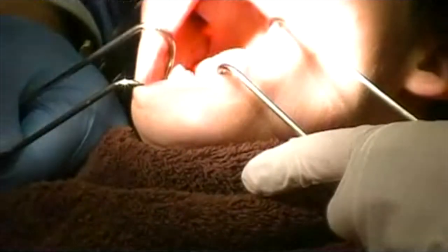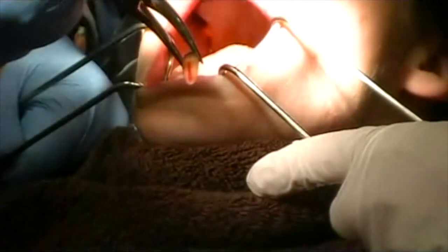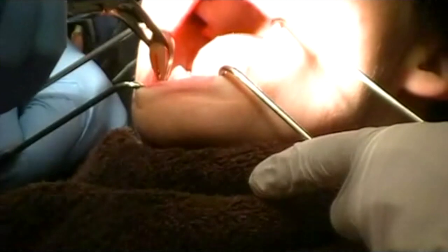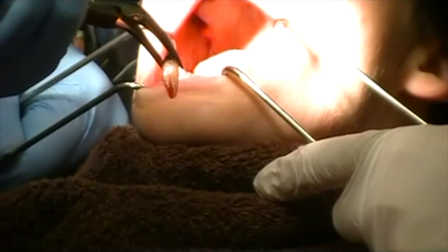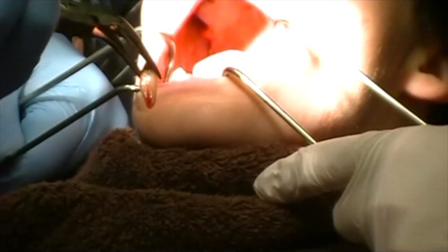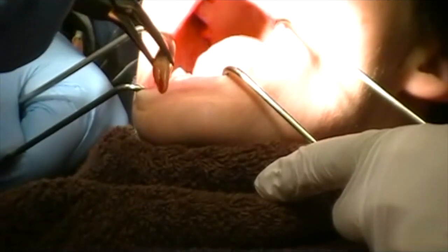Wow, look at that. Atraumatic extraction of a very long-rooted cuspid tooth that coronally is excessively decayed.